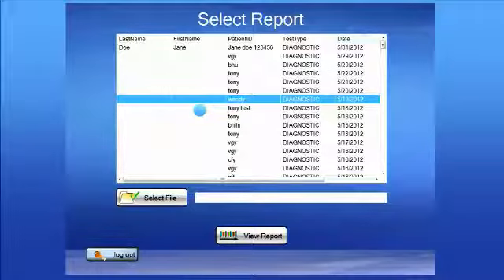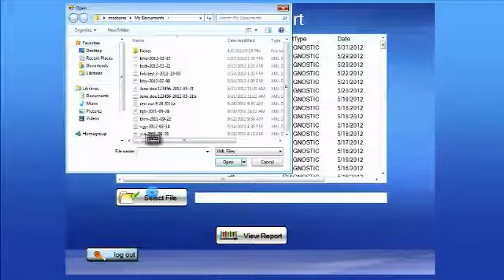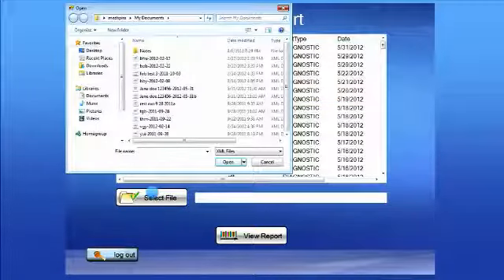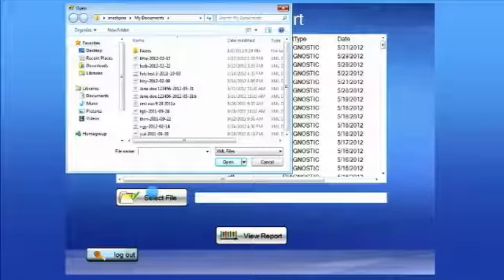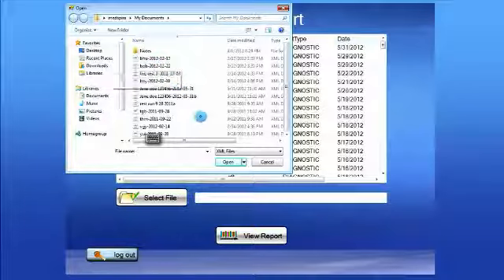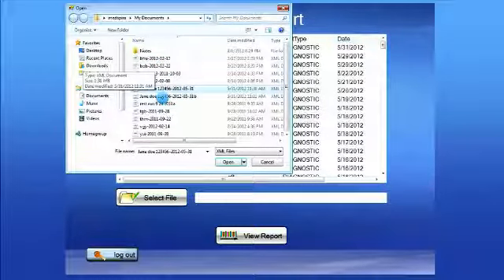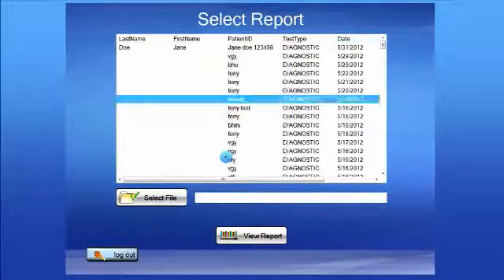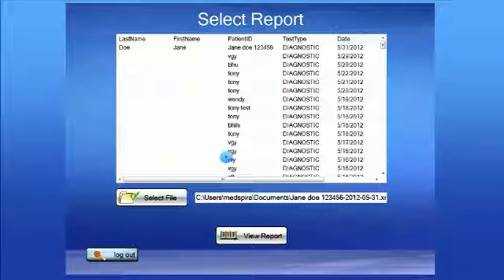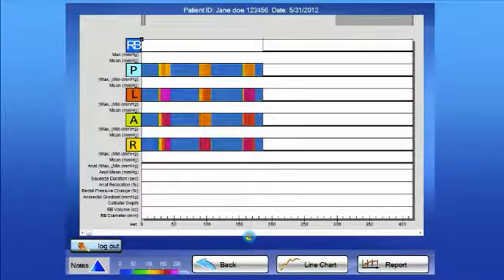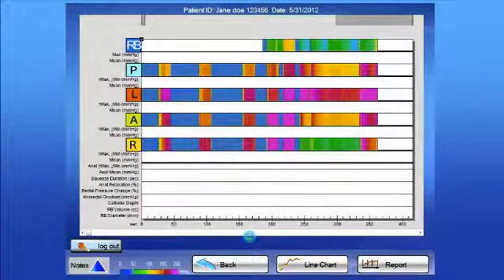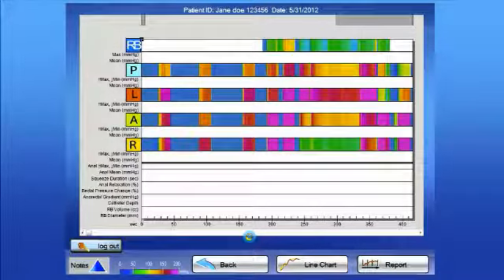If it happens to be a report that's been either emailed to you in encrypted form or is in a different folder than the one that's standard on the tablet PC, for example, the file is on a shared server, then you hit select file. And then it goes to the standard Windows library where you can find the folder that contains that particular test. You can pick up that test, highlight it, and hit open. It will load into the open space. Tap view report and up comes that report from that particular file.